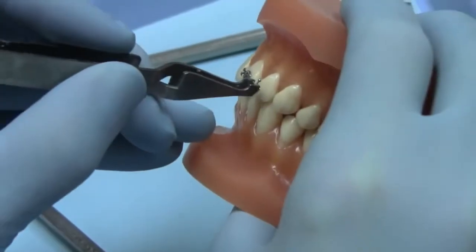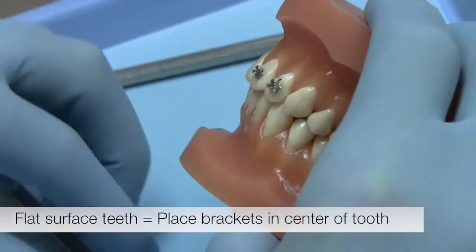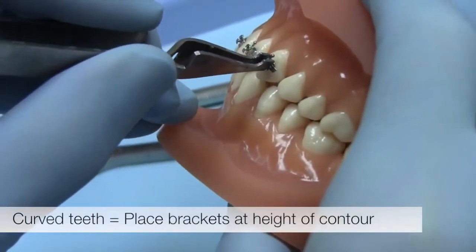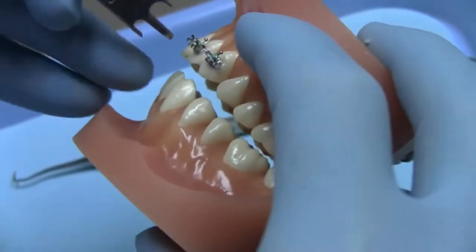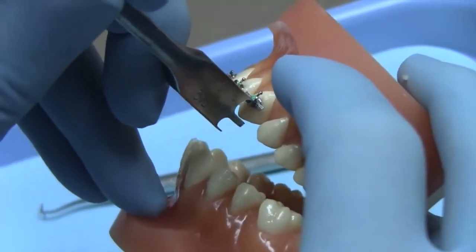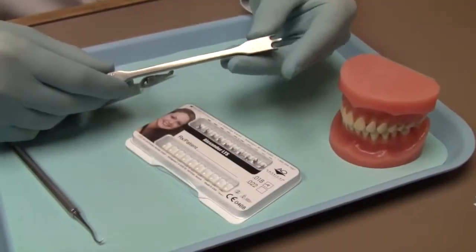If it's a flat surface tooth, centrals and laterals, you put the brackets in the center of the tooth. For cuspids and bicuspids that have a curvature, you want to place the bracket at the height of contour, not at the center of the tooth. If you do this, then no matter where the tooth is at the beginning, the wings will rotate the teeth and eventually move them to the exact positions they should be in. Now I'll show you how to properly place the brackets.